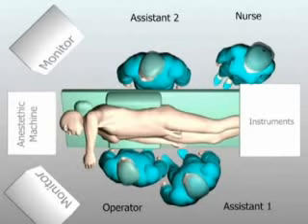In a left-sided adrenalectomy, shown in this video, the surgeon and first assistant are standing on the right side of the patient, whereas the second assistant and the scrub nurse are on its left side. The instrument table is placed at the foot and one or two monitors at the head of the patient. This setup provides excellent vision for all involved.